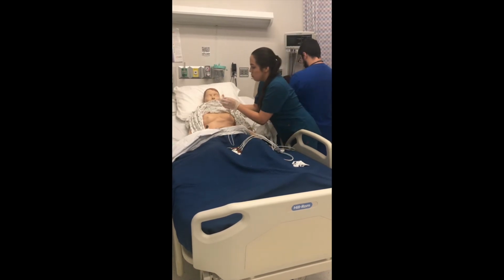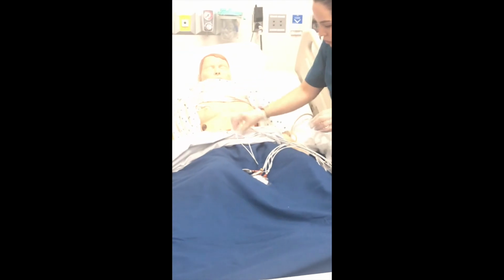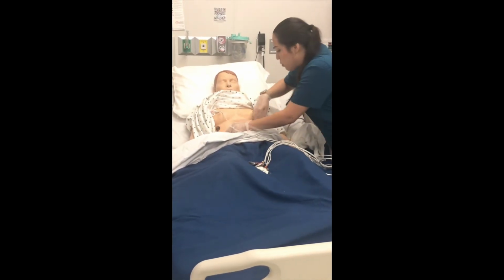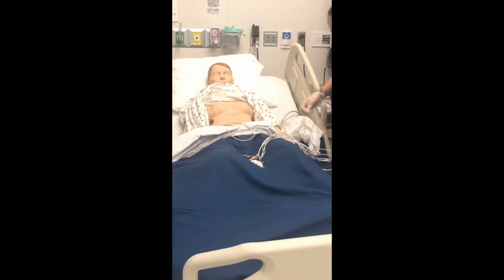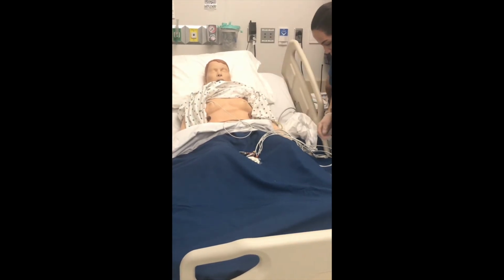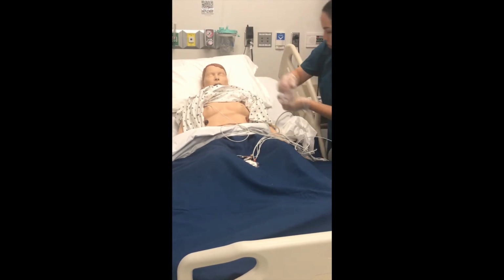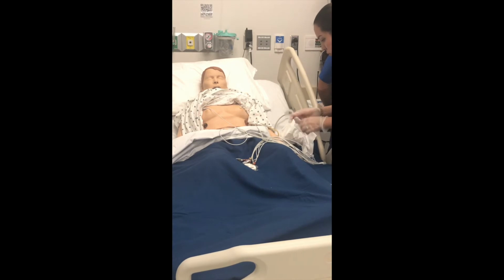We will be placing the white lead on the right upper extremity, the green lead on the right lower extremity, the black lead on the left upper extremity, and finally the red lead on the left lower extremity.